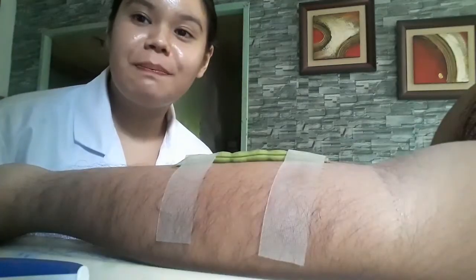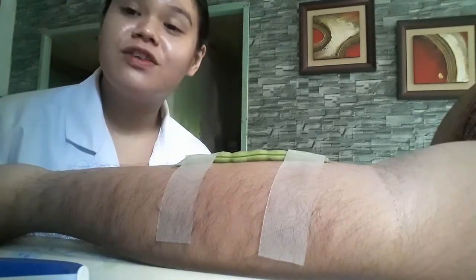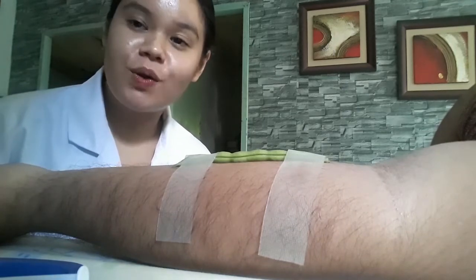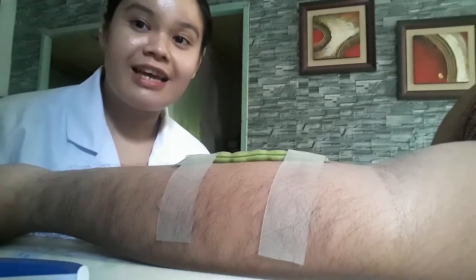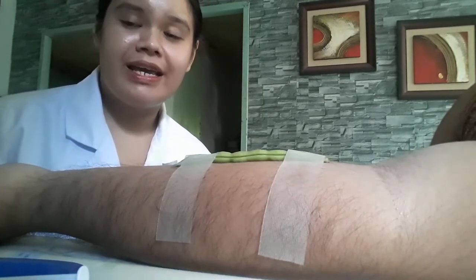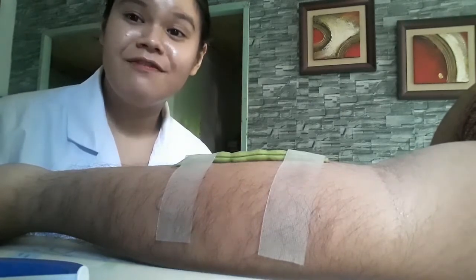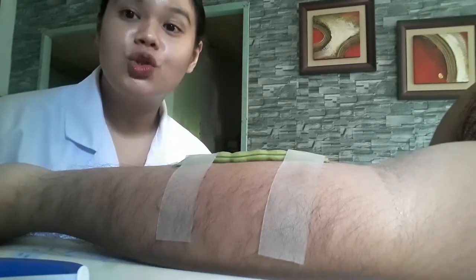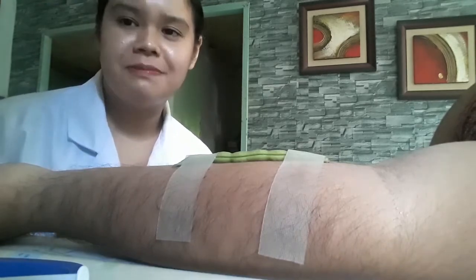Now we will apply our clean gloves. After applying the clean gloves, we will use the antiseptic or alcohol swab to disinfect the site where we will inject the medication. In disinfecting with an alcohol swab, we will do it in a circular outward motion, about 2 inches to 5 centimeters.